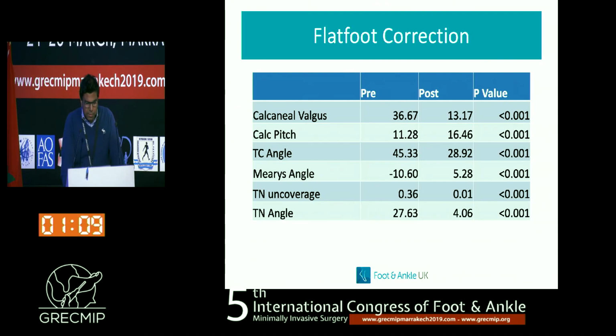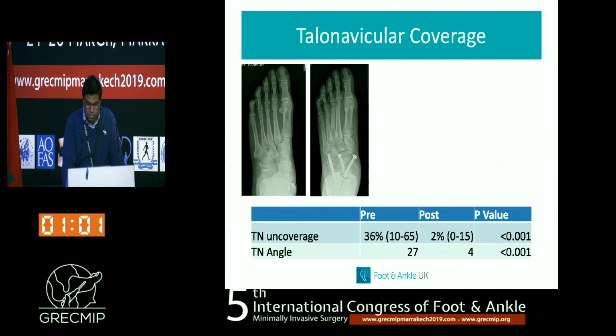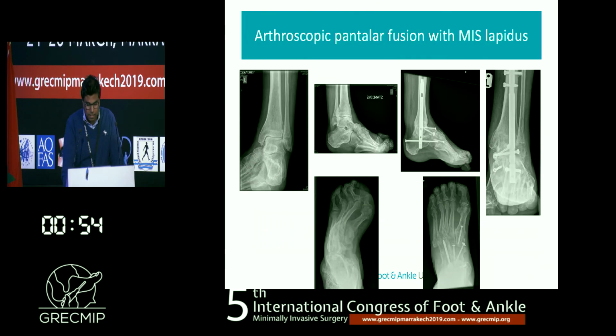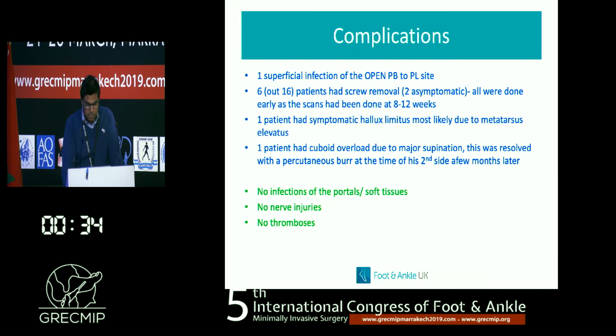These are the outcomes in patients with severe deformity. The average calcaneal valgus was 37 degrees pre-operative and went down to 13 degrees post-op. There was a significant talonavicular uncoverage and abnormality of talonavicular angle, which is corrected well. And to give you an idea of the kind of deformity, this is a patient who had an arthroscopic pantalar fusion with an MIS lapidus in one sitting. These are the right foot and the left foot. The right foot is pre-surgery and we're going to operate on them in a couple of weeks. The left foot was operated on last year.